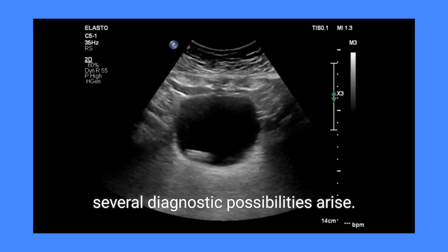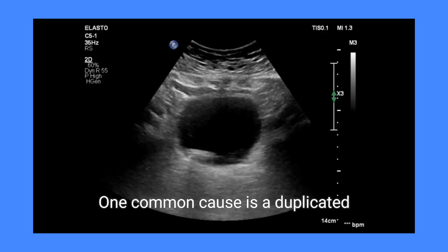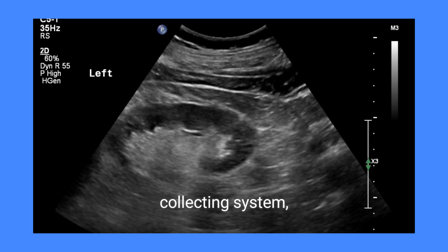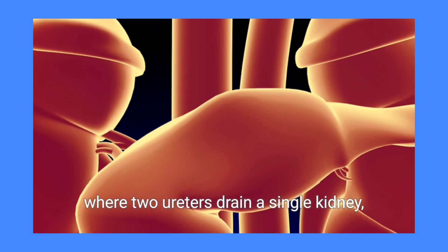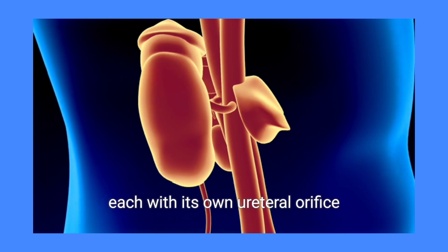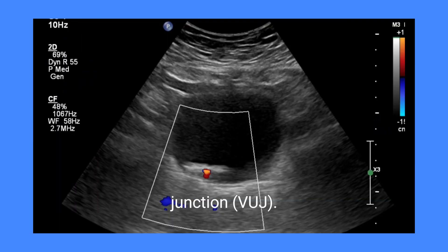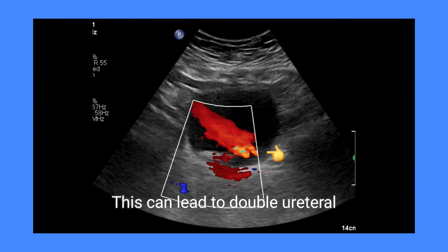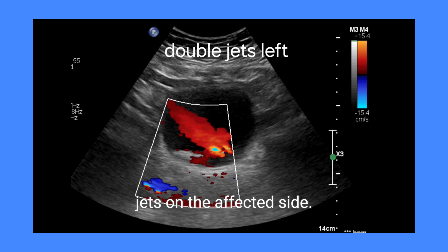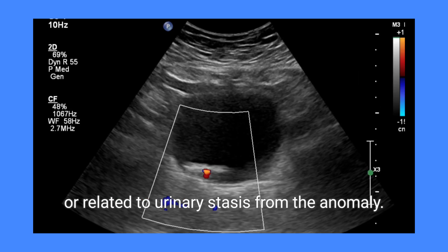One common cause is a duplicated collecting system, where two ureters drain a single kidney, each with its own ureteral orifice at the vesicoureteric junction (VUJ). This can lead to double ureteral jets on the affected side. The bladder calculus might be incidental or related to urinary stasis from the anomaly.